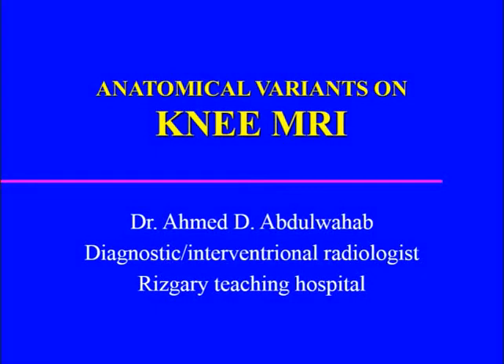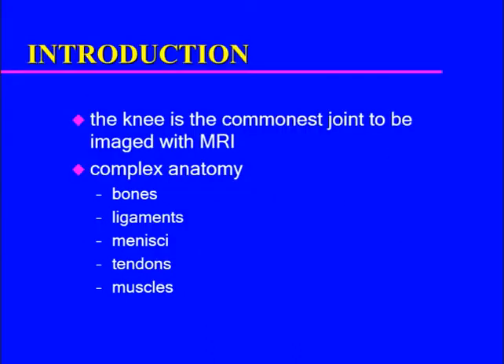Hey guys, so today I chose to talk about anatomical variants on knee MRI. The reason for this rather unconventional topic is that as I was reading on knee MRI, there were so many variants that I'm sure most of us don't know about, and some of them are very similar to some disease processes that might give us some confusion. So we need to know what's going on there.